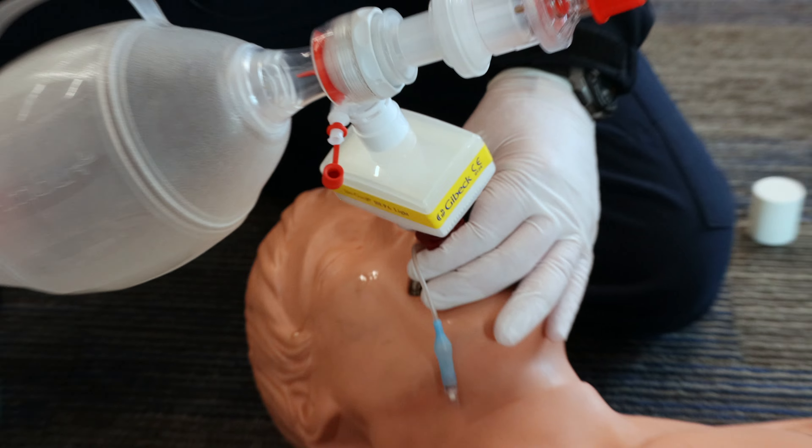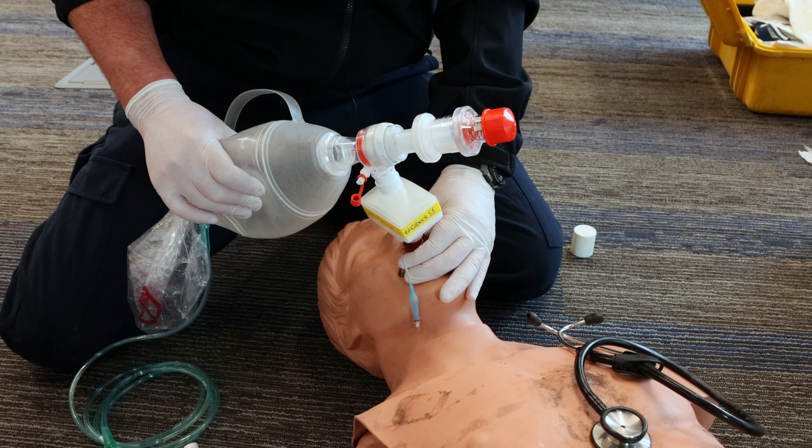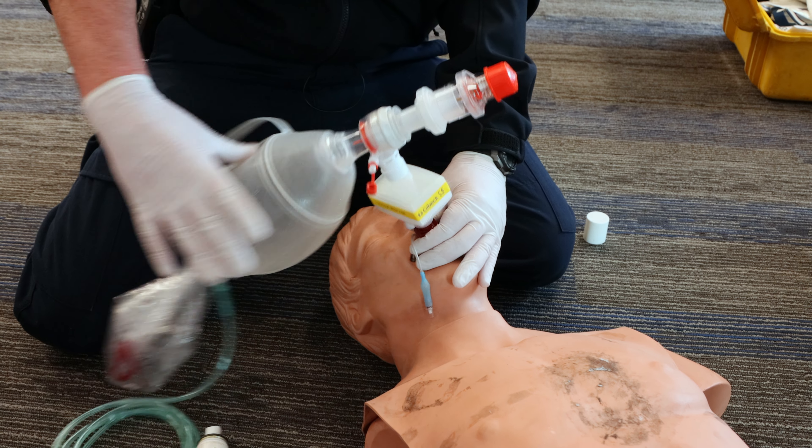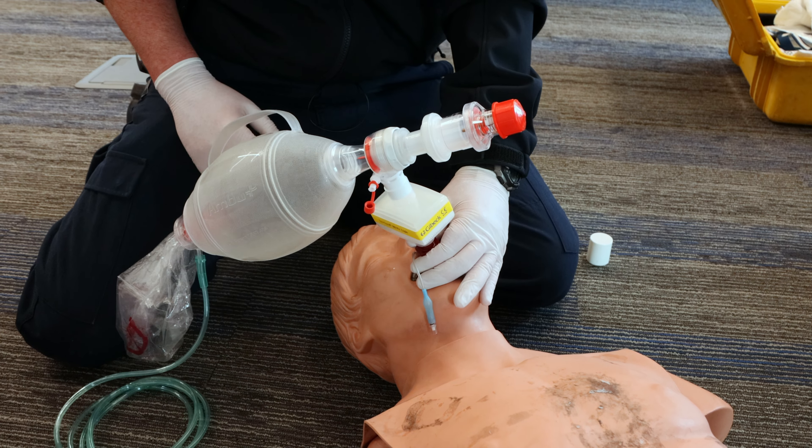Again, checking for your epigastric sounds, your breath sounds, and then tidal as well.